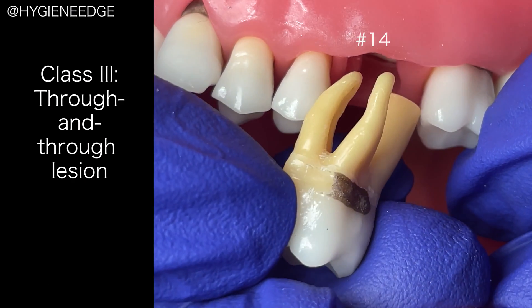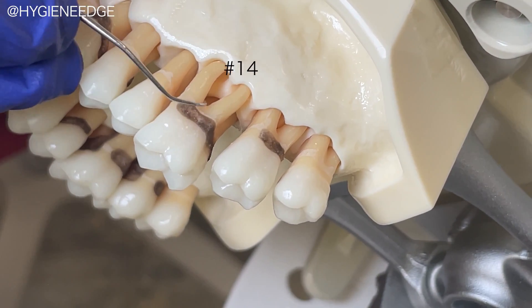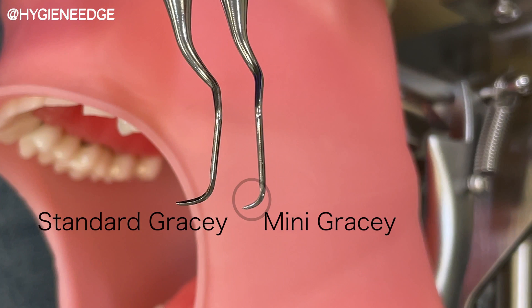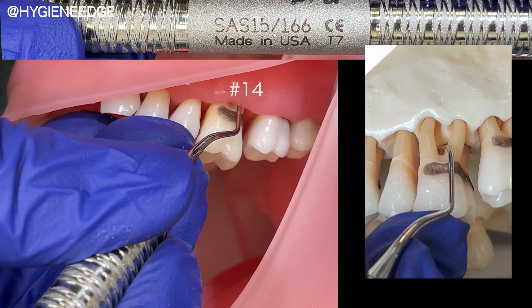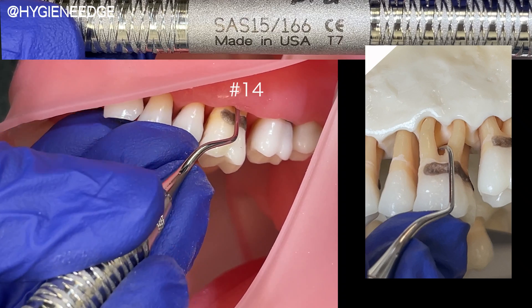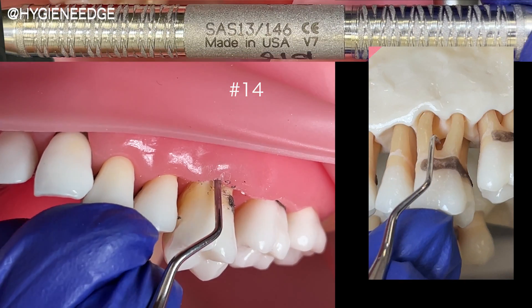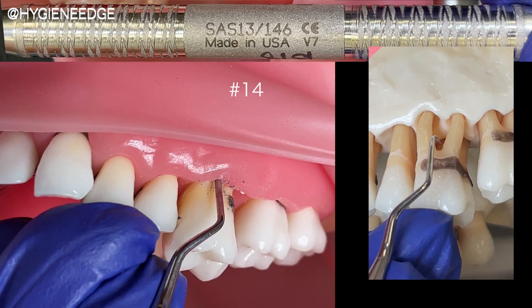With class 3 furcations, the attached tissue and bone have migrated apically so much that you have access in between the roots. To instrument this area, you can use a mini Gracie 11-12 or 15-16 on the mesial of the distal root, and a 13-14 or 17-18 on the distal of the mesial root. Treat these two roots almost like two separate teeth.